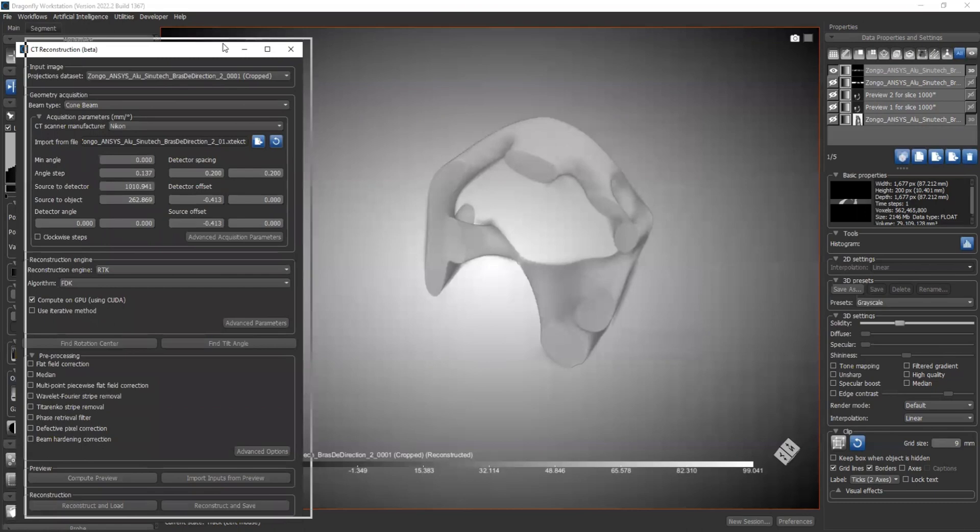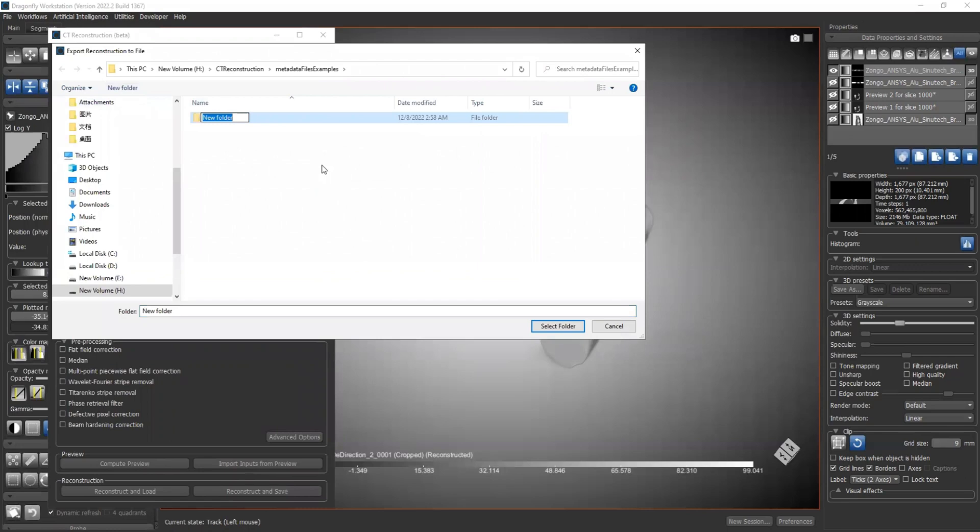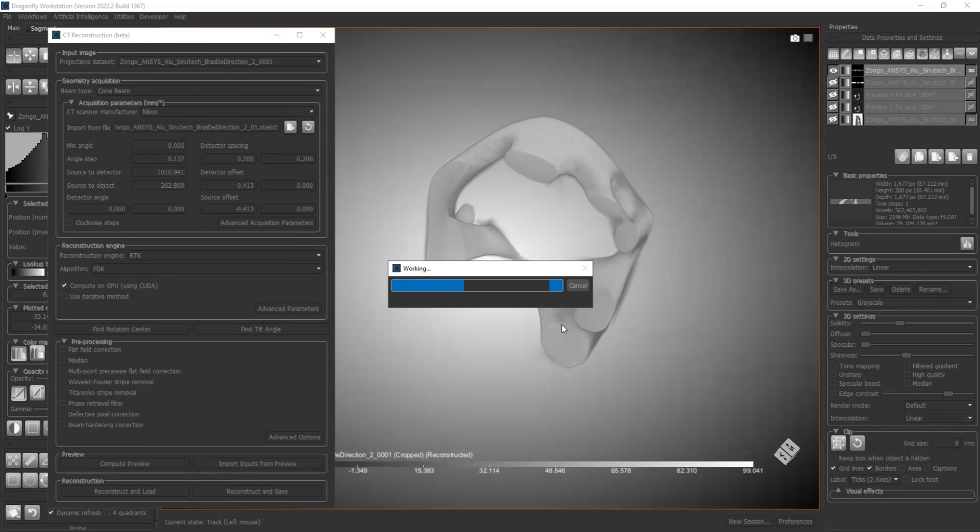Okay, the other option we have is we can use reconstruct and save. Before that, let's change it to our original dataset. We can say reconstruct and save. And we need to create a folder - it's going to put all the results over there. Select folder. Okay, now it's working.